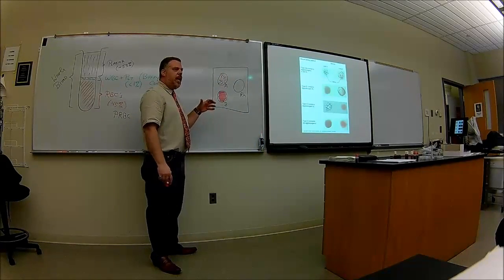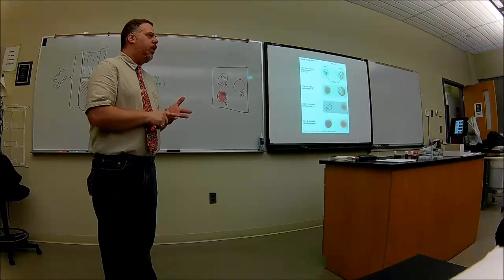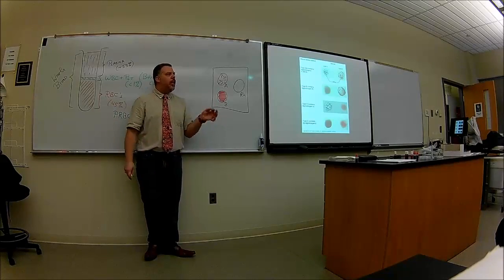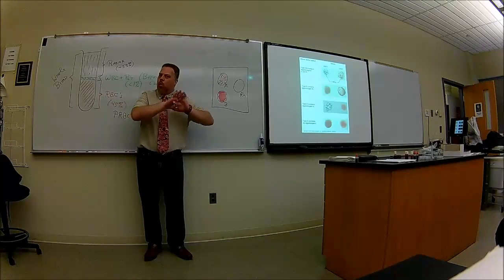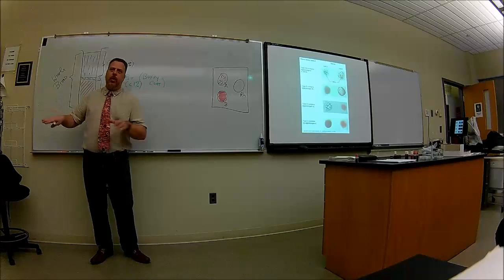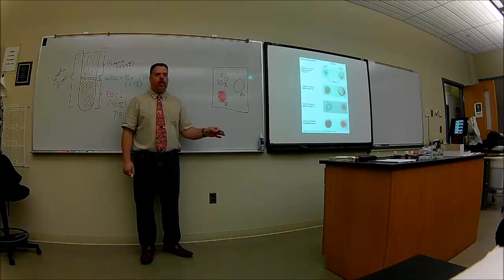So in this particular instance, you have antigens to A, you don't have antigens to B. So right now, you could say that this person's blood is type A. Don't get the positive and negative. I know people think of, well, that's O negative. We'll worry about positive and negative later, okay? That has nothing to do with the ABO blood grouping. So right now, we can say that this person's blood type is A.